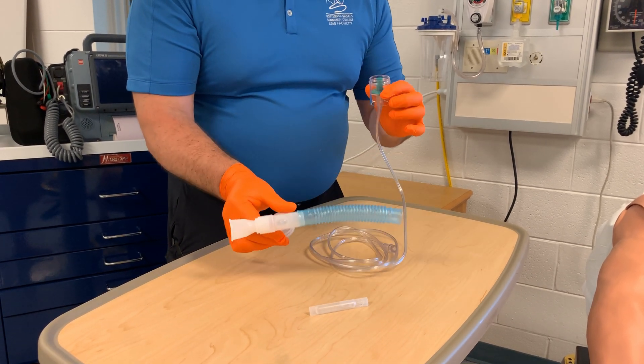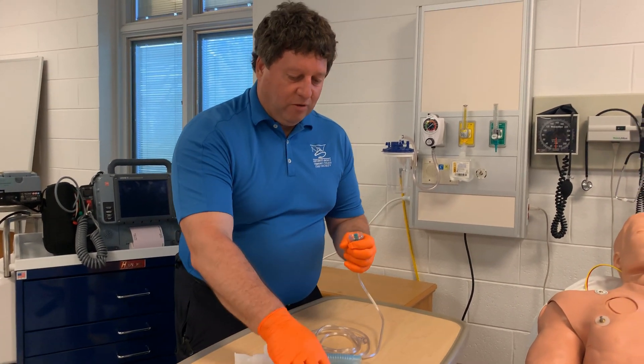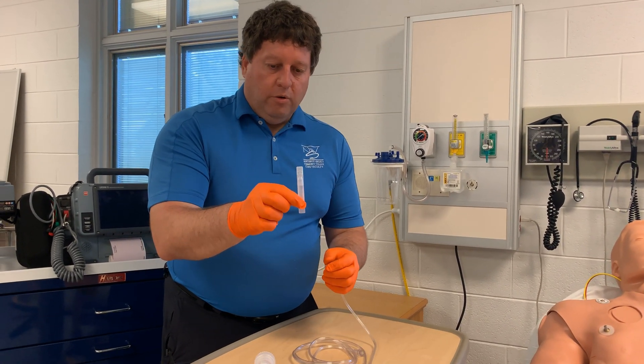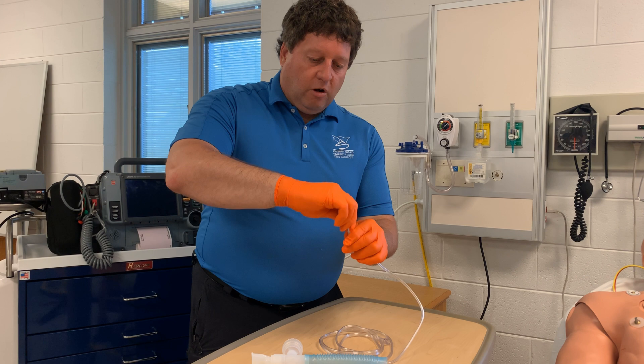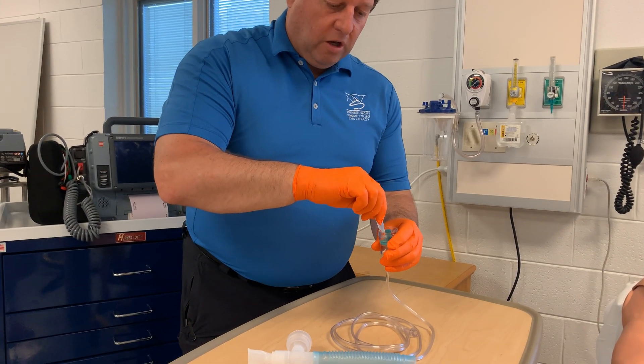I don't want to assemble it yet because I have to put the medication in, and this is where it gets a little tricky in the back of the ambulance where you don't want to spill it. Your nebula is here — it'll twist off the top and then you can squirt it into the container.